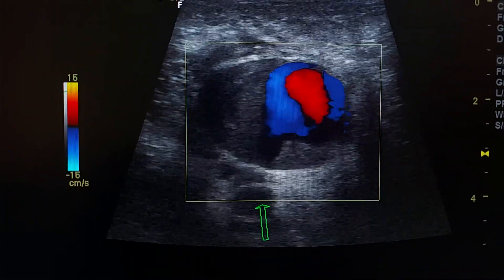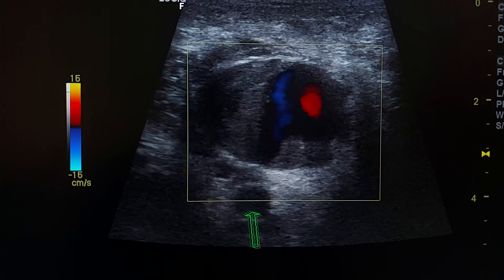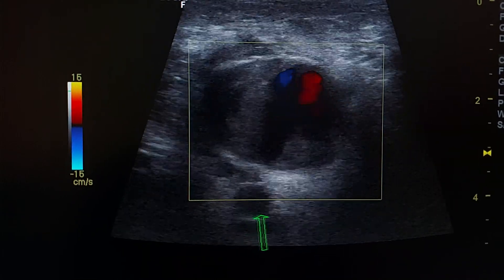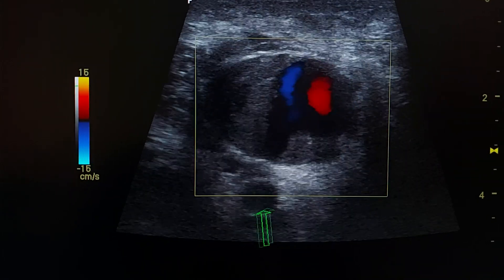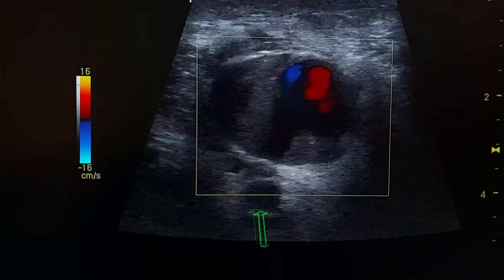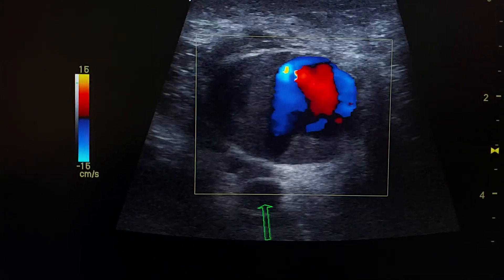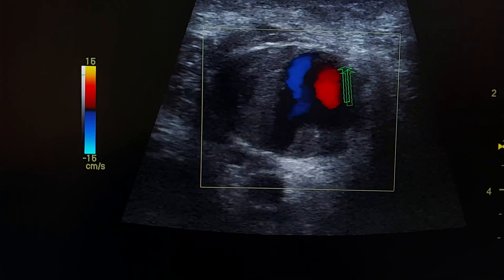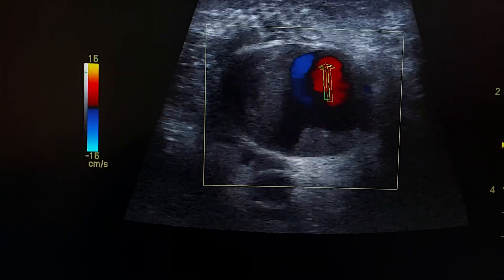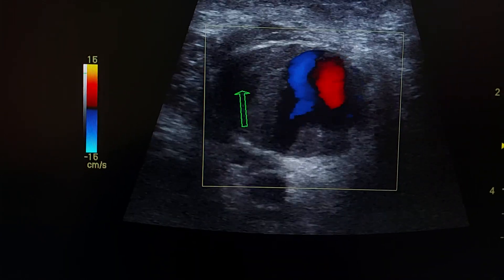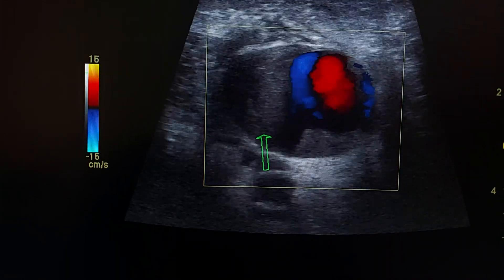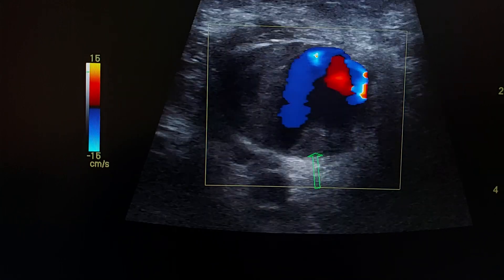In transverse section, this is the superficial femoral artery and this is the pseudoaneurysm. This is the mural thrombus.